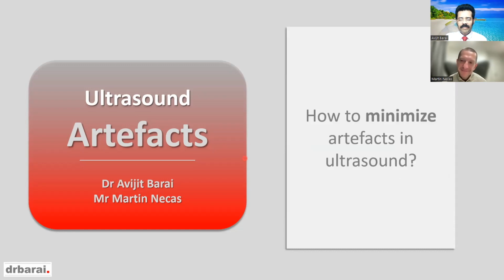And we briefly talked about, actually, we talked about quite a lot, and you mentioned there are different techniques to minimize these different types of artifacts. Absolutely. Yeah. So if I was to give one big word of advice to people, it's good acoustic window. Good acoustic window is 80% of all the effort that should go into ultrasound. Finding a homogeneously transmitted window that does not generate artifacts is where the money is at.